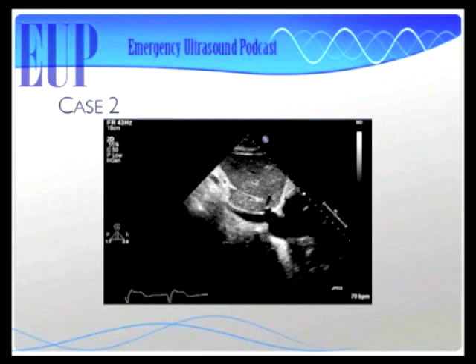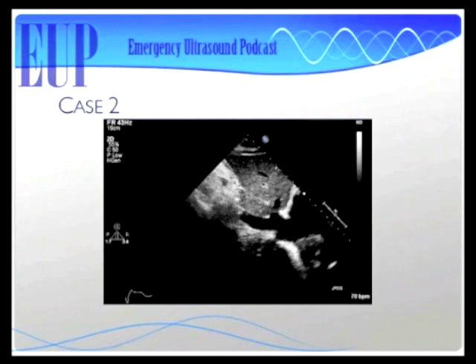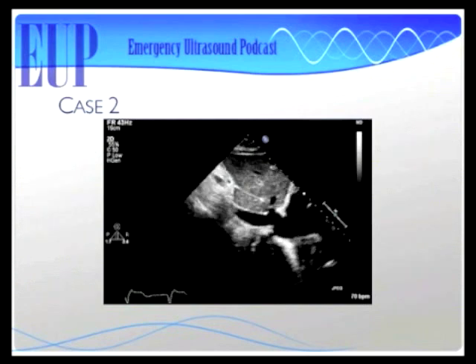So we got a normal heart. We got a normal IVC. Why is this patient short of breath? They're probably malingering. Yeah, probably.